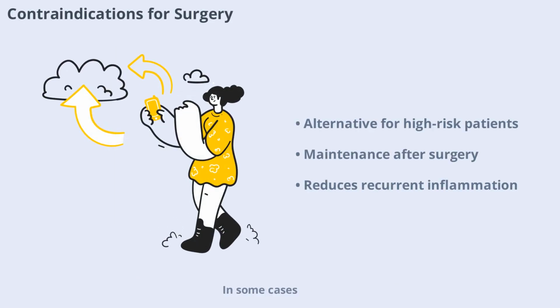In some cases, extensive periodontal surgery may be contraindicated due to patient age or systemic health complications. For these individuals, gingival curettage offers a less invasive alternative that can still provide significant therapeutic benefits.